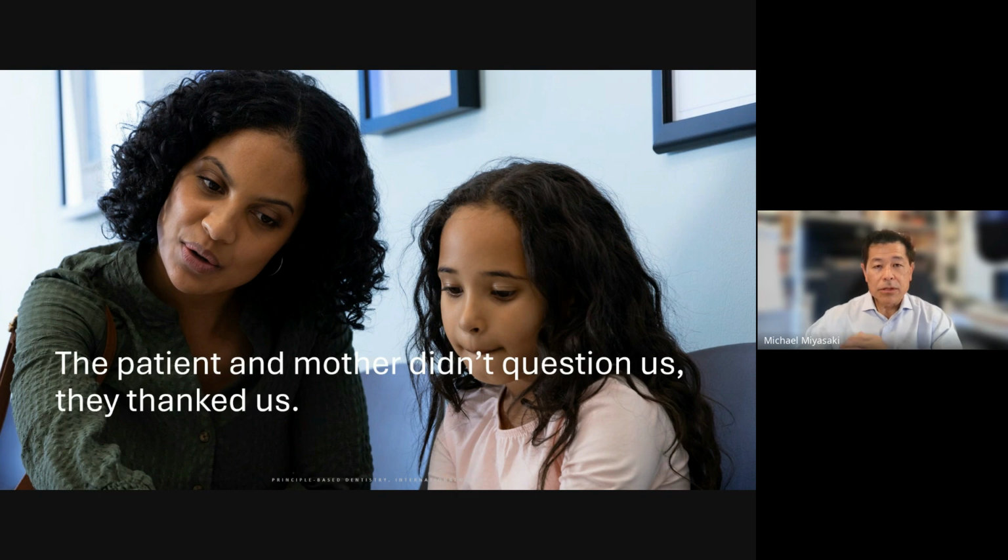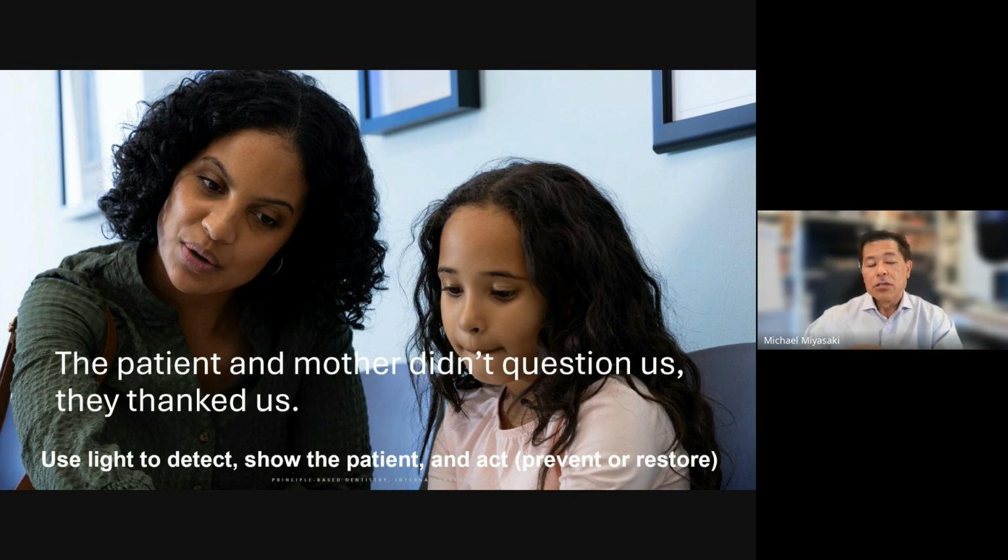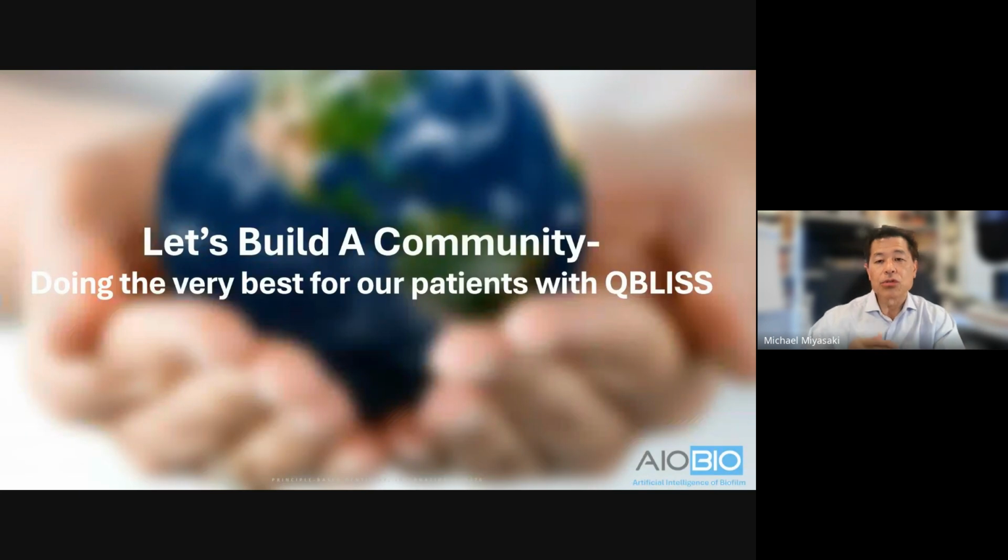When we got done with the procedure, they thanked us because they really understood what we were trying to do, and they really appreciated that we were able to treat that patient without having to do the root canal. So we're able to use the light to detect things, in this case, not so early. It would have been nice if we could have done it a little bit earlier, but we're able to show that biofluorescence to the patient so they understood the situation, and then we were able to treat.